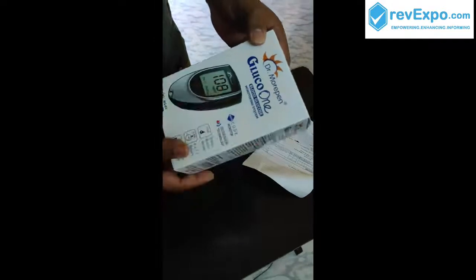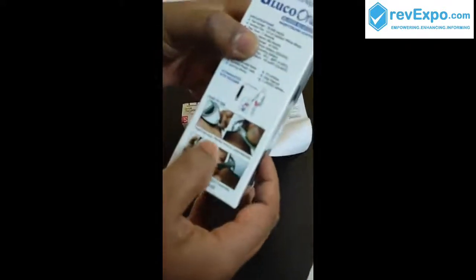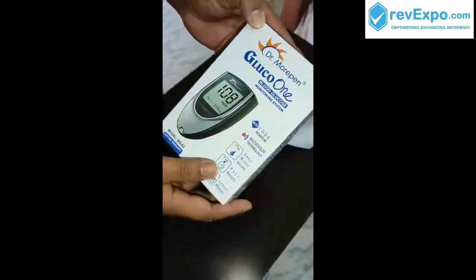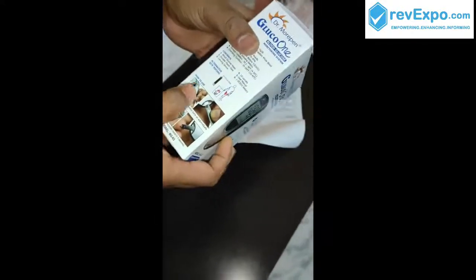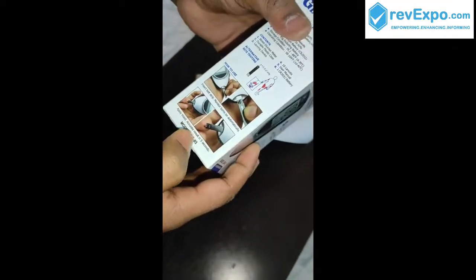You can see here. This is the machine — Gluco 1 blood glucose monitoring system by Dr. Morphen. Here is the machine. And how to use: insert test strips, monitor turns on automatically. Accurate results in 5 seconds.